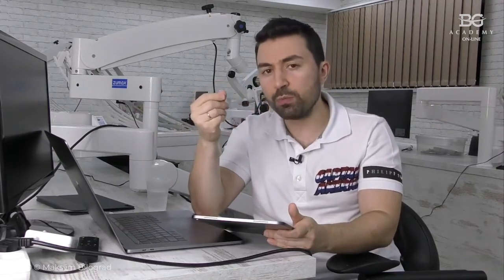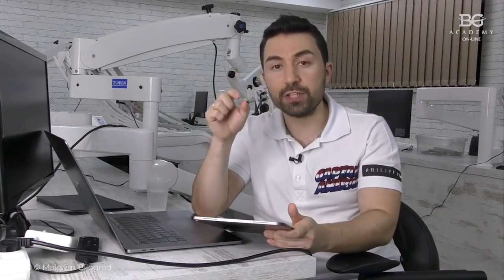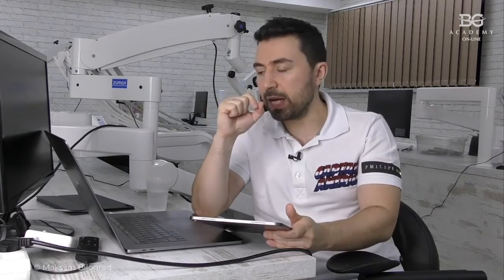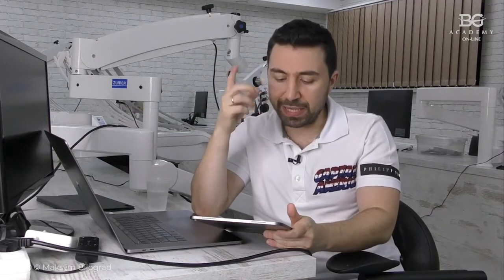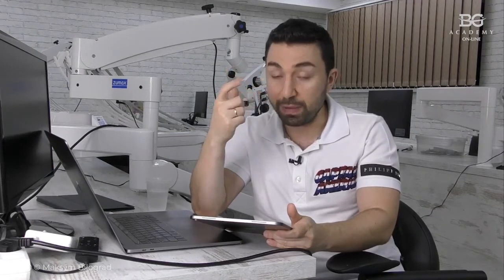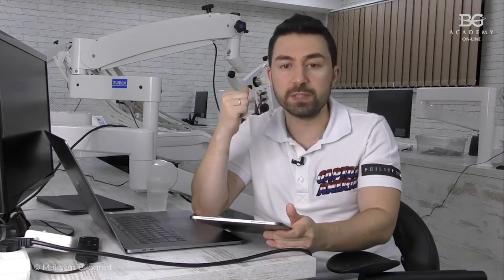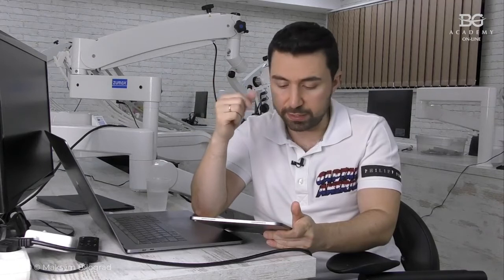And as you may understand, taking good care of these small things takes time. For 8 veneers, it depends also on the case, but one tooth may take from 10 to 30 minutes. So the average time that I spend for veneer cementation is about 15 minutes for one tooth. So you can calculate how long it will be for 8 teeth.